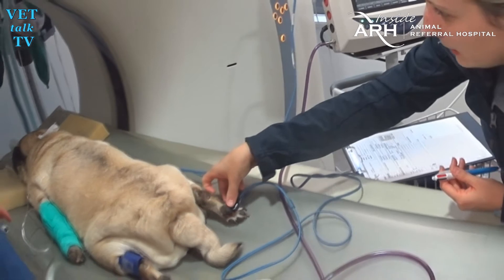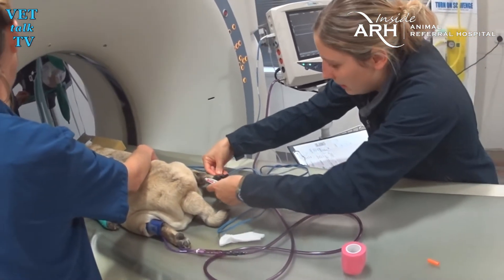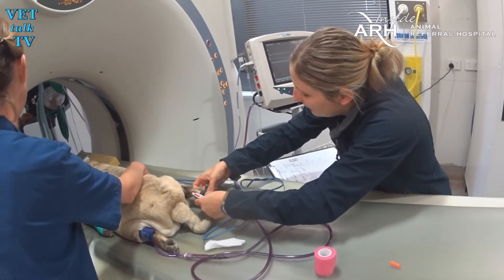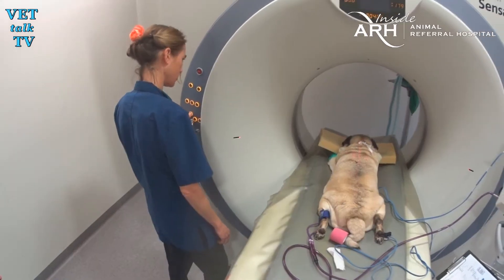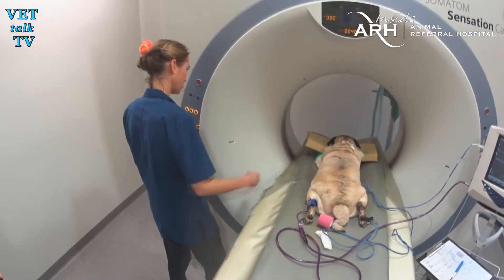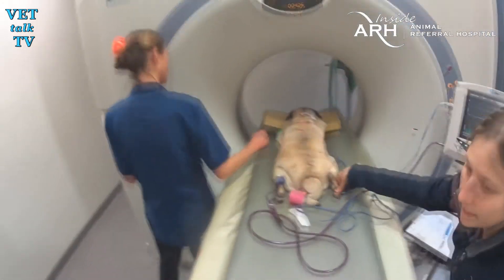This is the Animal Referral Hospital's fifth scanner, and while its predecessor was pretty good, this machine is so much better. It's technology able to take even sharper images of either soft tissues or bone in just seconds, meaning the pet has a shorter anaesthetic and a lower dose of radiation.